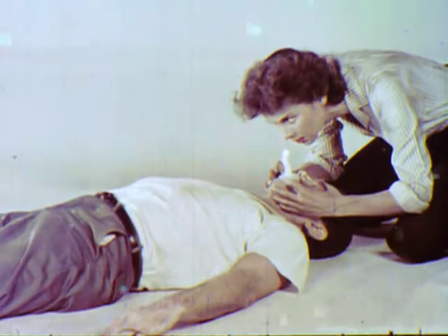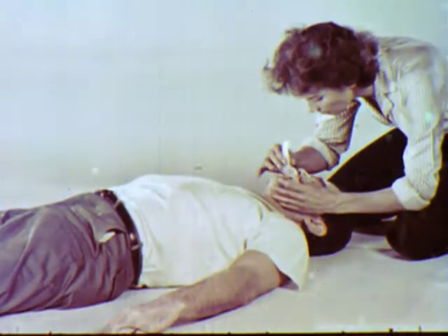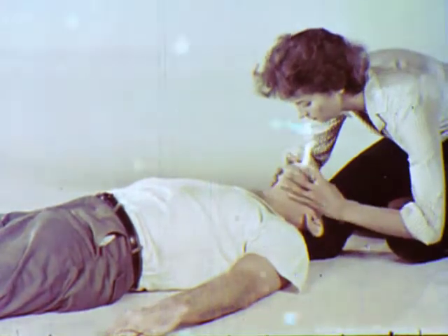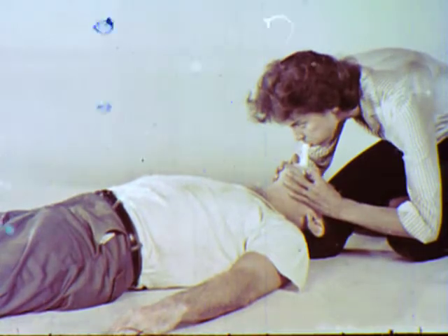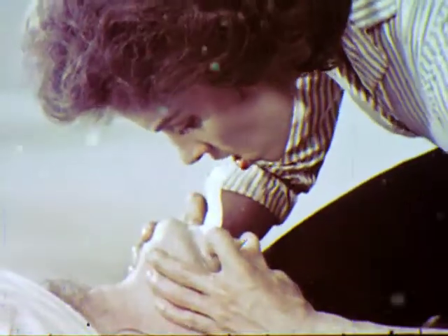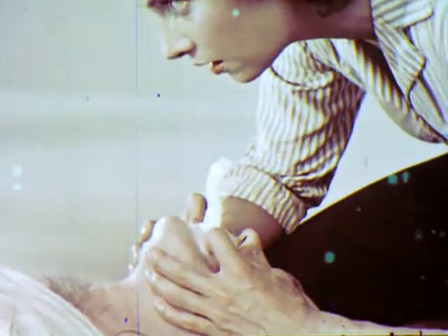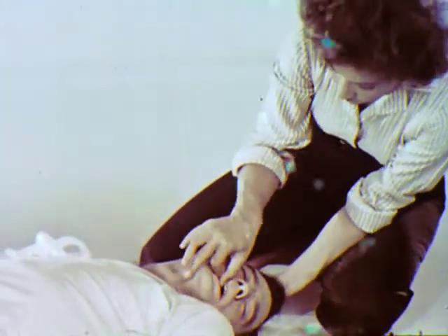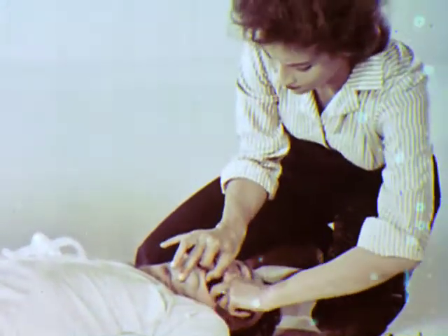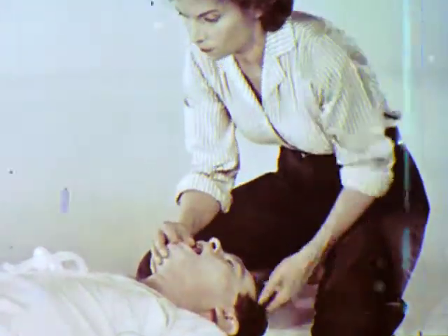Repeat the inflations every two to five seconds. Again, timing and rhythm are not important. If the chest does not rise, readjust the position of the tube. Increase the chin-up position. Press more firmly on the flange and blow more forcefully. If the chest still does not rise, remove the tube and check for foreign matter. Make sure the tube is clear and reinsert it.